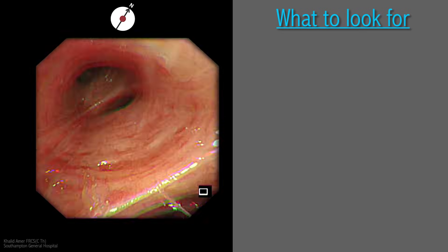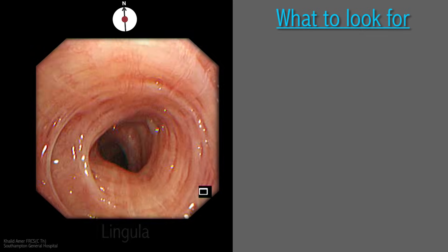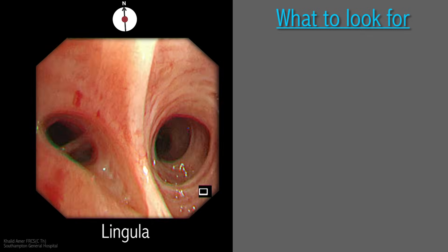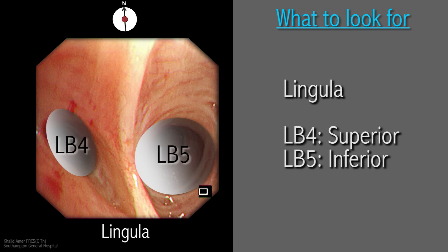The scope is then introduced into the lingula to expose the two segmental divisions: the superior (LB4) and the inferior (LB5).